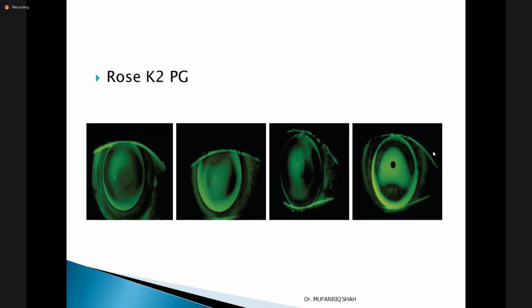So this is an early graft actually. You need to wait for it. In cases of early graft, we already discussed that the pooling will be from 0.2 to 0.3 millimeter. So here the pooling is much greater.